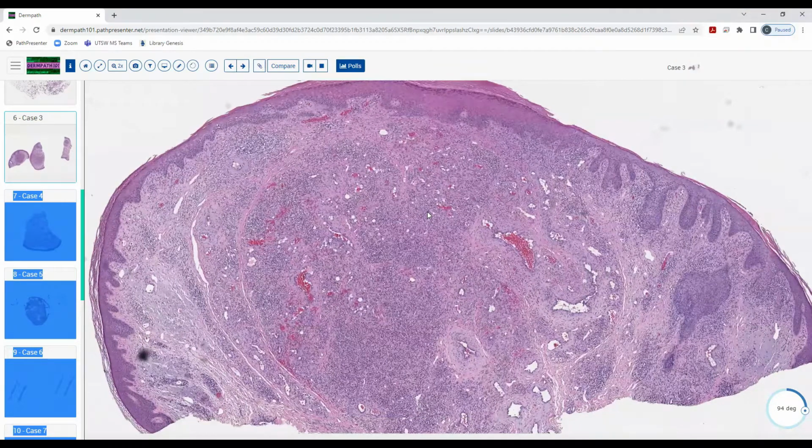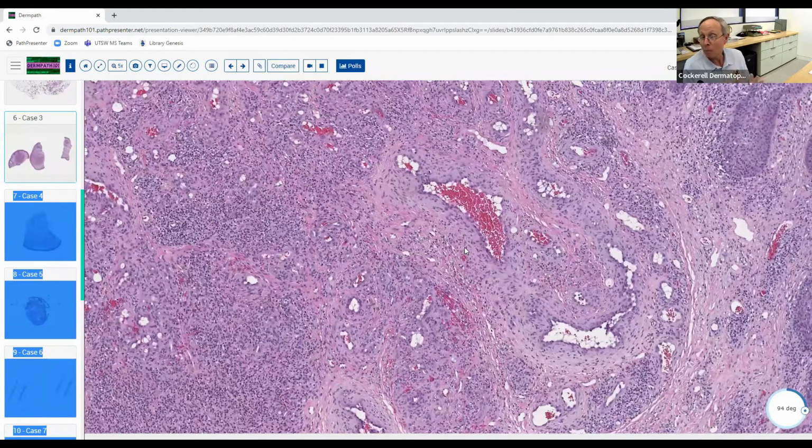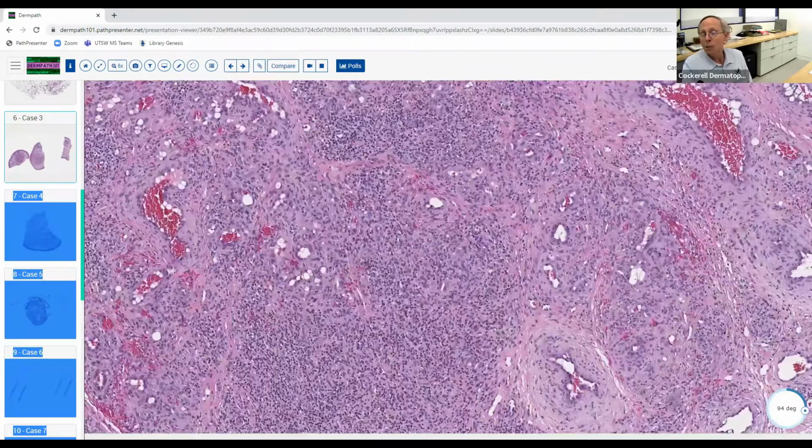What about like the Kimura? Yeah, there you go. Kimura's disease, or angiolymphoid hyperplasia with eosinophilia. So angio, lymphoid, it kind of looks like a lymphoid. It is hyperplasia because it's not really even thought by everybody to be a neoplasm. A lot of people think it's actually kind of a hyperplastic reaction pattern, often related to trauma in some cases, with eosinophils. So you get a lot of eosinophils in the infiltrate of these lesions very commonly. So this is a beautiful example of this.